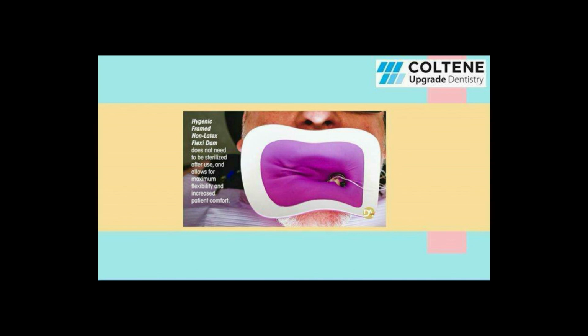The rubber dam frame which you are able to see over here is quite flexible, so it is easy for you to place your X-ray film or your RVG sensor, or if you want to administer local anesthesia again, you can do this quite easily.